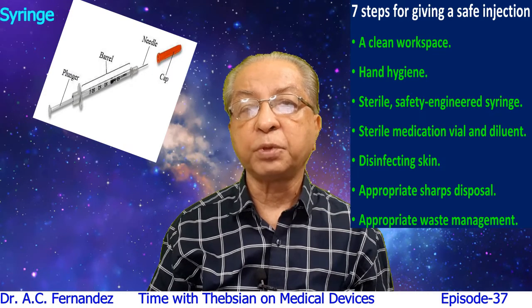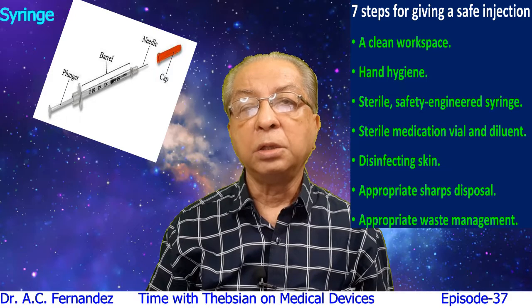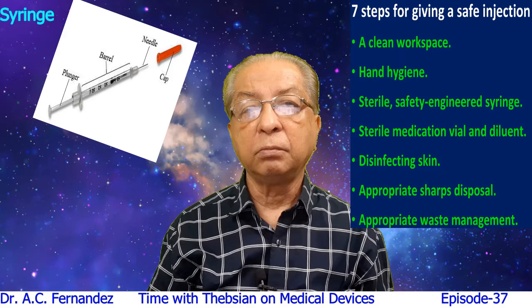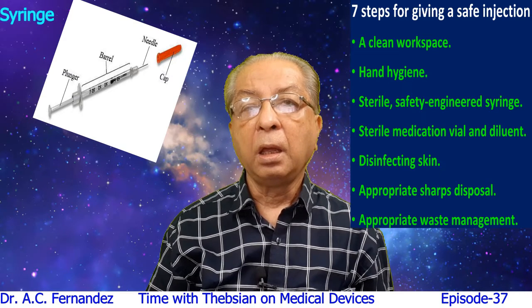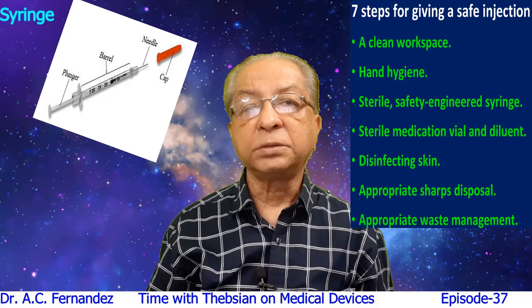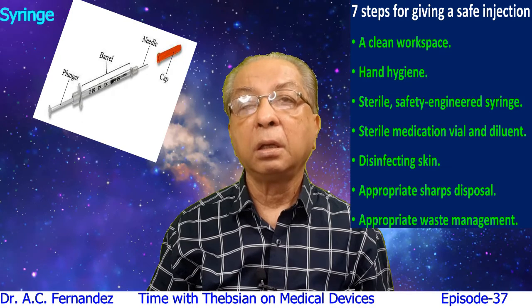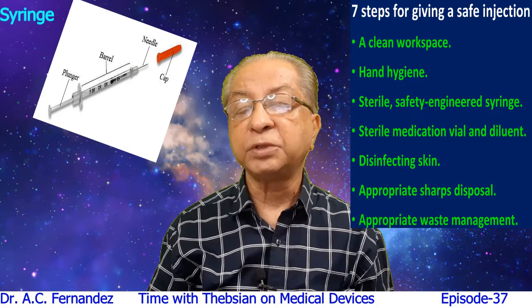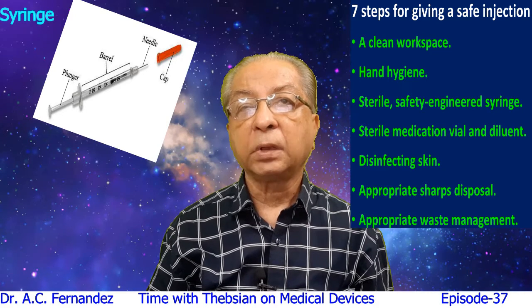Appropriate sharps disposal should be available before injection, so that after injection the needle and the syringe can be disposed properly. Last one is appropriate waste management practices.